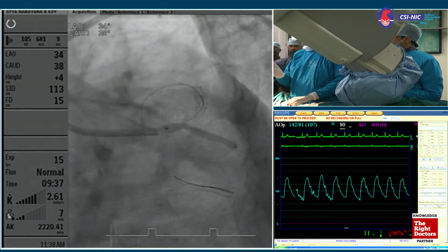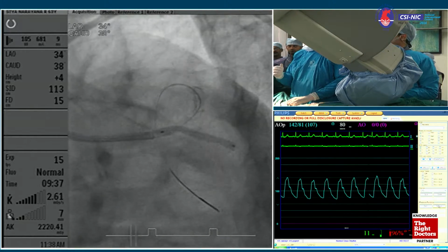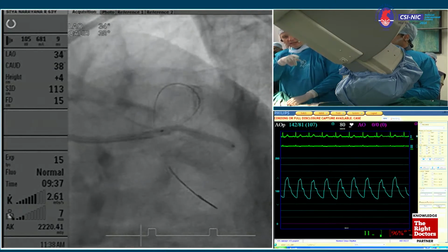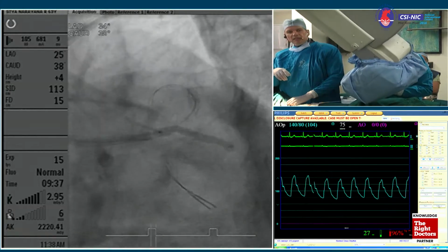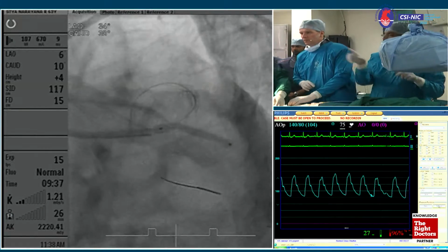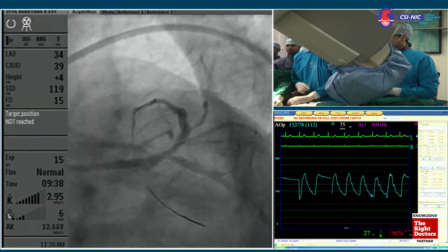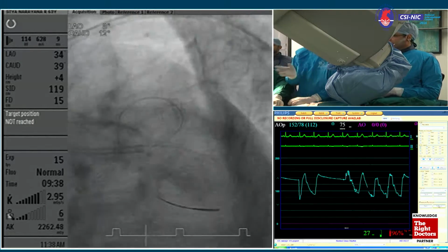We know where the plaque is. We can do all that. At the end, the stents from 3.0 onwards. Maybe I can look to the people. So we'll take one shot. We have not taken a shot. Are you planning to culotte in this case? Just a quick shot. Okay. Go. Quick shot. Okay, it's all fine. Yeah. So maybe I can just look.